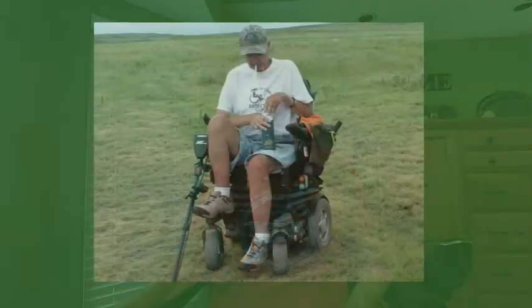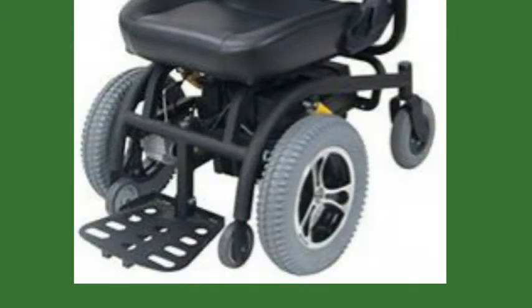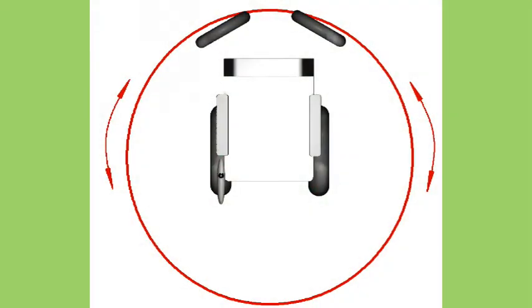Let's discuss them now. If you intend to use your power chair outdoors where sidewalks or uneven terrain exist, a front or rear drive configuration may be the best for you. The large drive wheel located in the front wheel drive configuration will help power the chair up and over an obstacle. The front drive is great for turning in tight corners as long as you account for the tail spin room needed for the rear casters. The downside of the front wheel drive design is that it is more difficult to steer at high speeds.